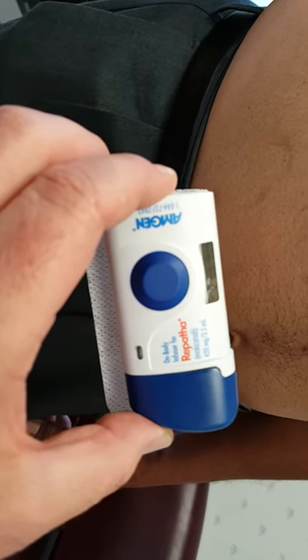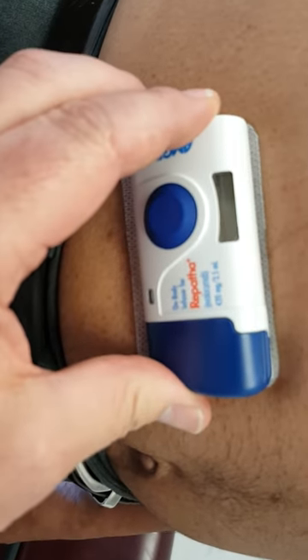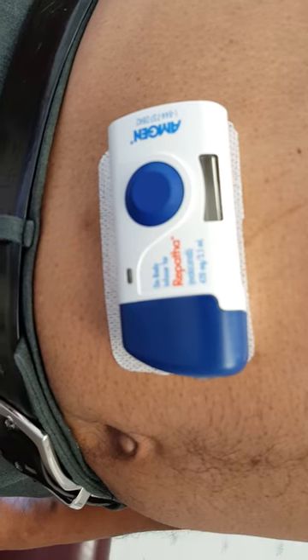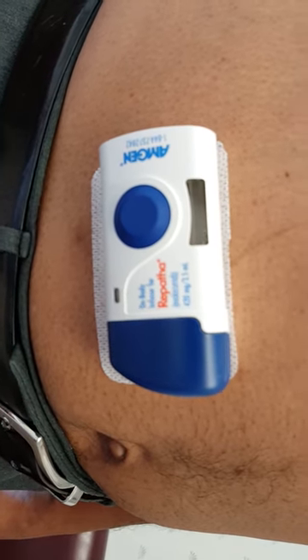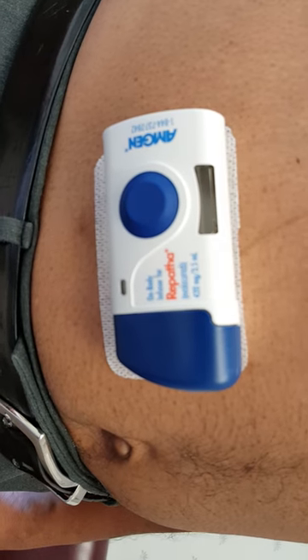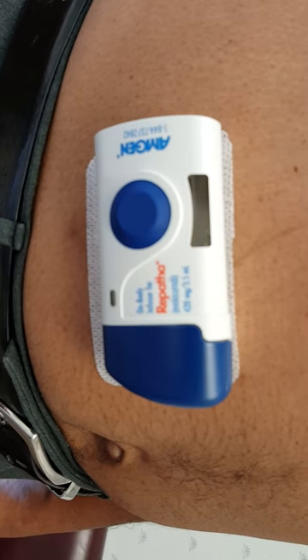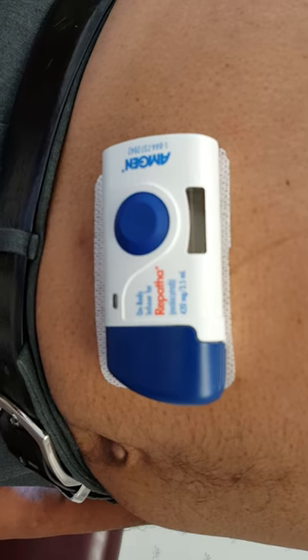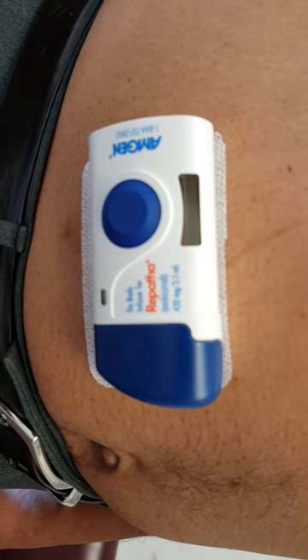What you do is take the device over and stick it onto the skin — very simple. Then you press the button, and the button just starts injecting the cholesterol medication. And that's it. It runs for 10 minutes, and you can go ahead and walk around and do whatever you want to do. After 10 minutes it stops and beeps, and then you can just remove it.